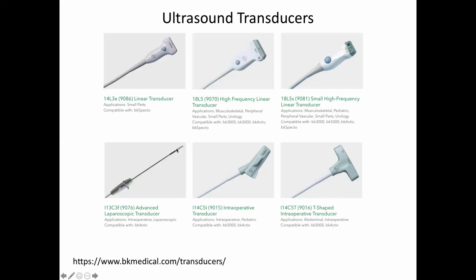This is an ultrasound transducer right on the end of a laparoscopic tool. So if you're in there and you say, oh, what the heck is that thing, or is there a vessel under here that I should really be worried about? You just lay it right on the tissue inside the patient and say, oh yeah, there's a big vessel under there. Don't pull on that thing. And then you come back out, right? So there's a whole bunch of these.